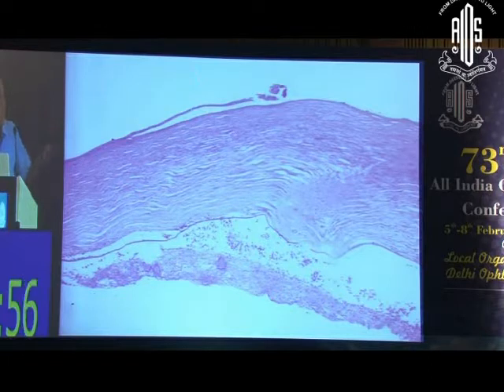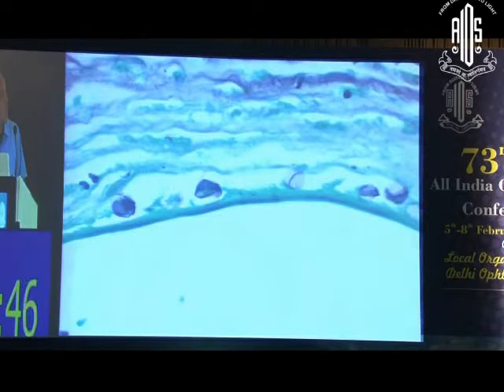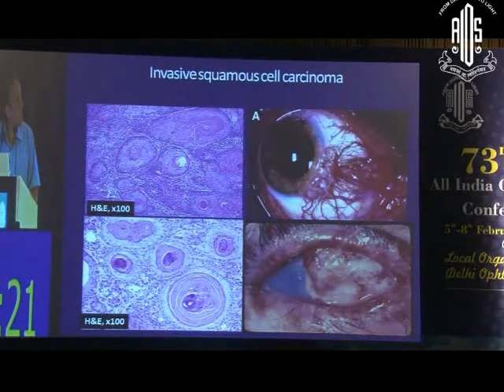You have full thickness infiltrates. You have a rupture of the Descemet's membrane. The infiltrates are present even in the anterior chamber. You have multinucleate giant cells. What stain is this? GMS. And what are these? Do they look like microsporidia? No. What are these then? Very good, acanthamoeba. And what is this? Calcofluor white. No? This is showing acanthamoeba. Okay, let's skip this.